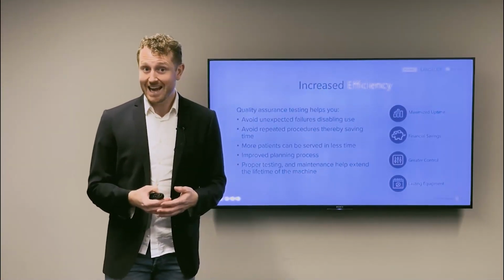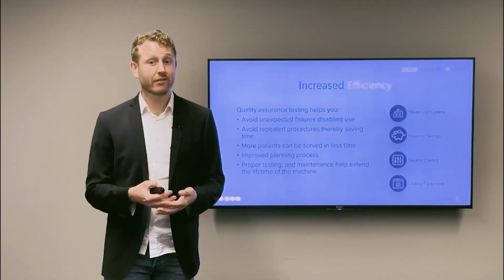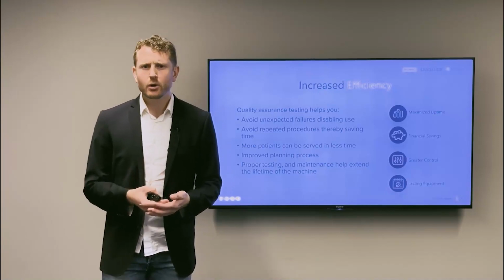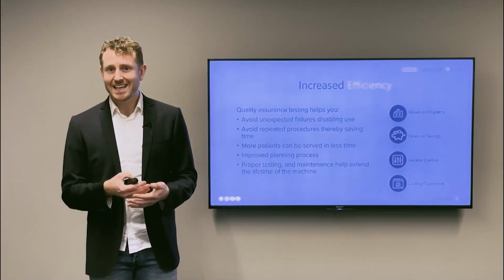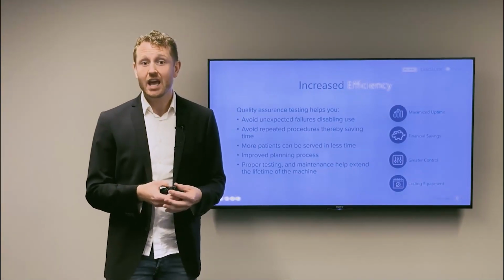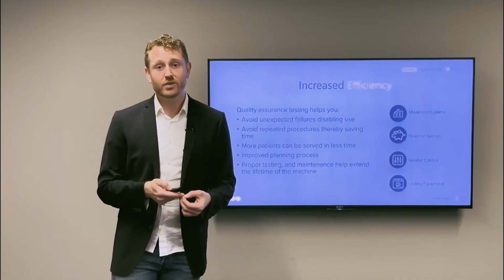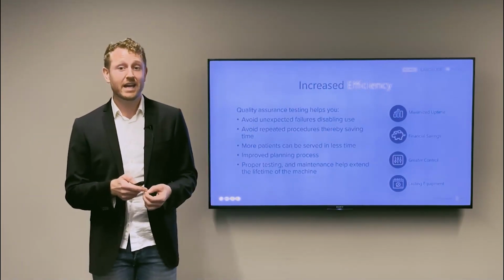The worst case scenario is that the wrong diagnosis is made due to lack of information, but multiple images taken due to low quality also lead to higher dose to the patient and longer screening sessions. Longer screening sessions also mean fewer patients per day.